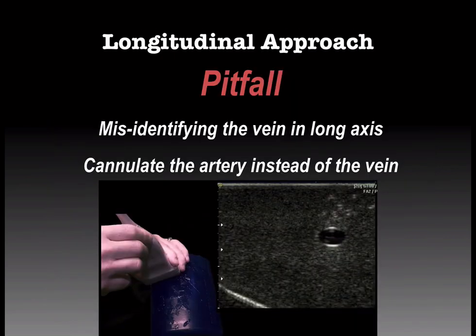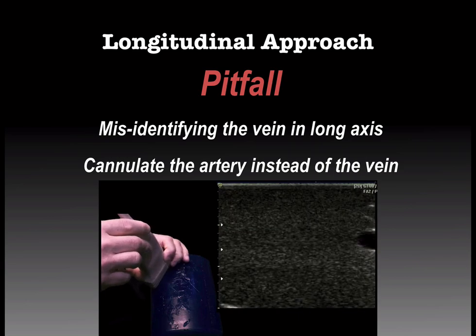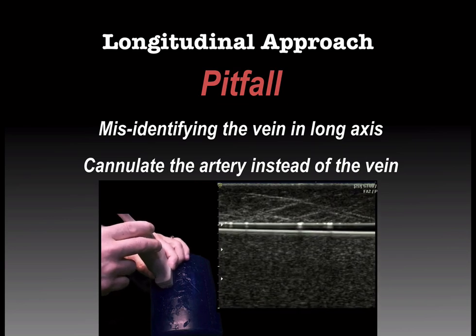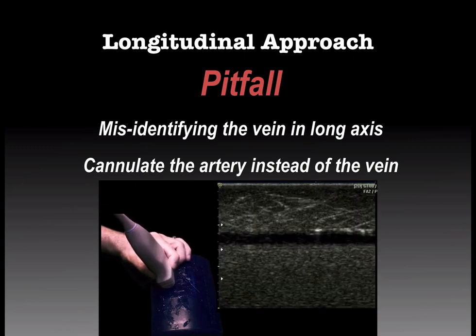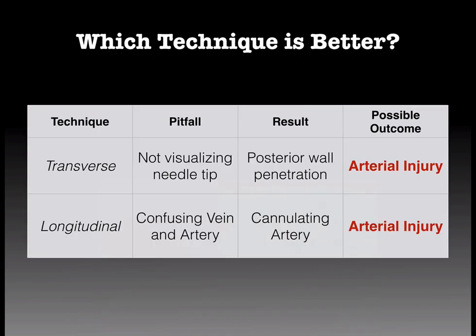But in reality, this is more difficult than it seems because you have to rotate from short axis to long axis without letting the structure go off the screen, because once you get to long axis, two parallel lines, you can't do the compression technique anymore. You don't know if you're compressing because it's a vein or you're sliding off the side of an artery. So the pitfall with doing long axis is that you cannulate the artery.